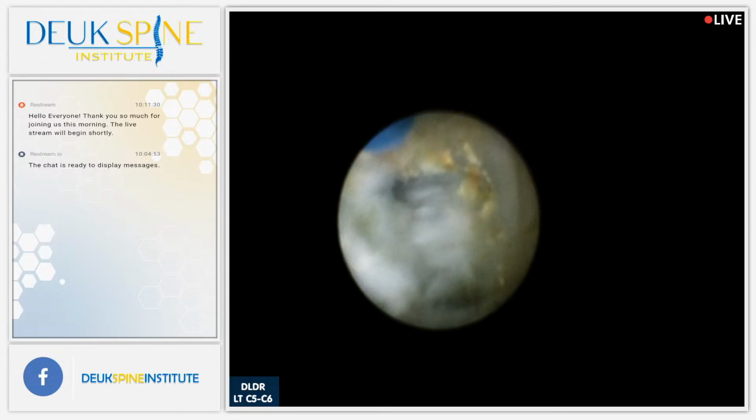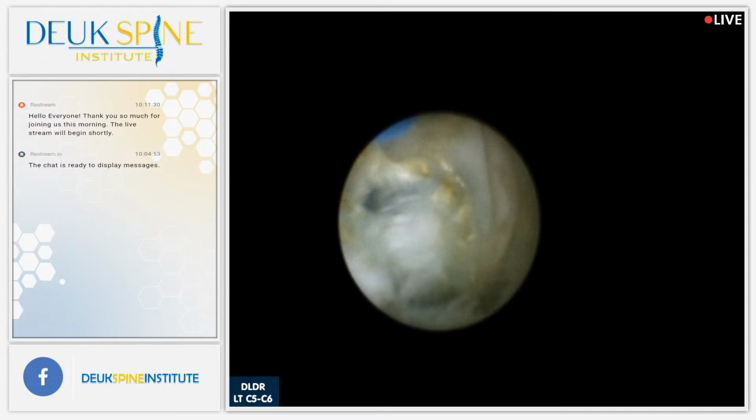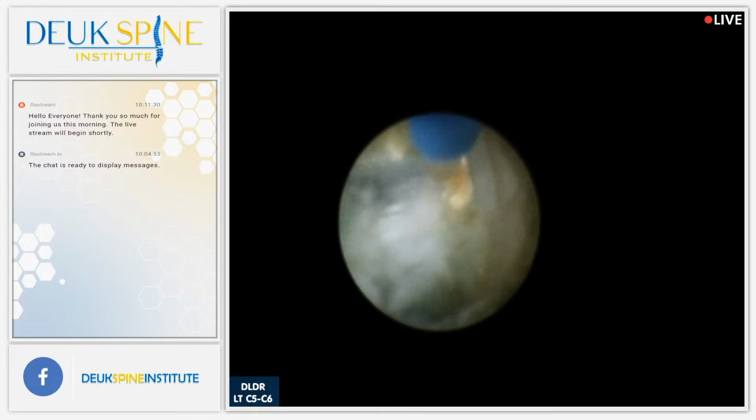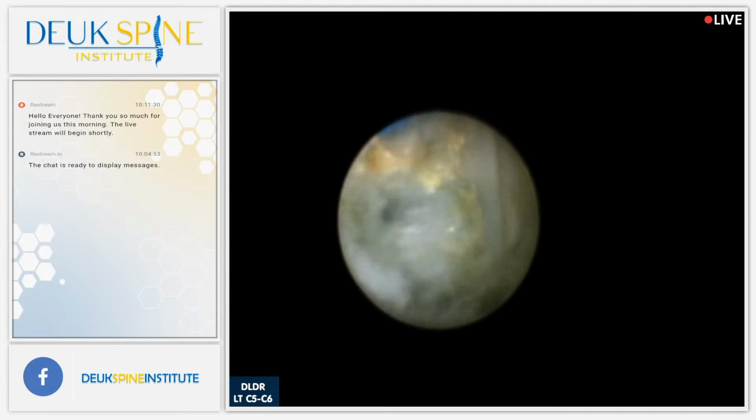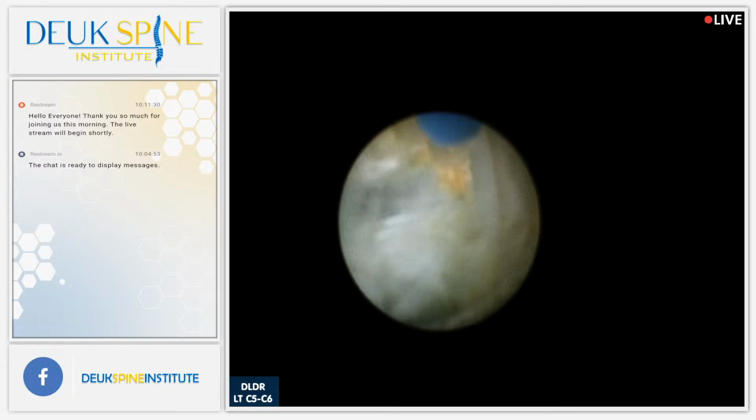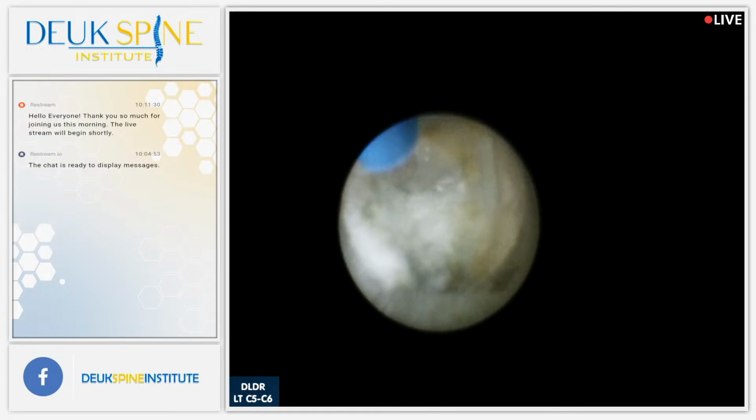So they're needed to be used together. Let's put it that way. The laser by itself is not enough. It's a tool that's extremely precise, but if you can't see at that precise level of detail, which is what the endoscope allows, then it doesn't matter how precise the laser is, you're never going to be able to use it precisely. Does that make sense? It's kind of like having a rifle without a scope. Think about that. There's the tear, by the way, where his herniation went out.